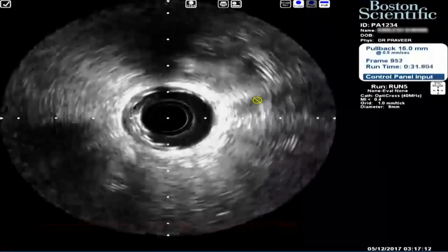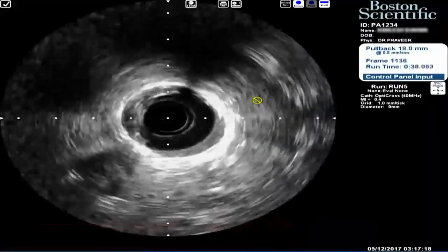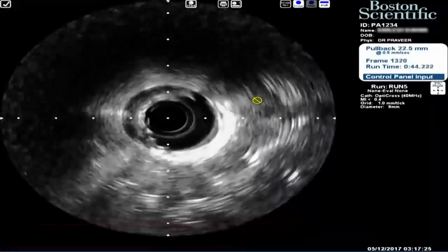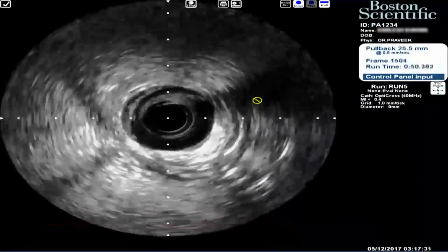But the proximal stent is well expanded now, but that area remains the same. So there's no gap, it's just underexpanded. I haven't found laser to be actually very useful. I think it's only used in 2.5 calcific cases after stenting. It's not used for anything else.